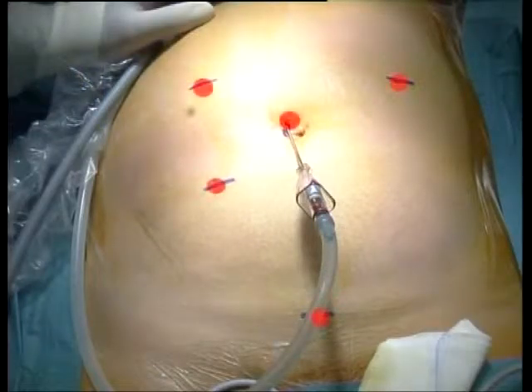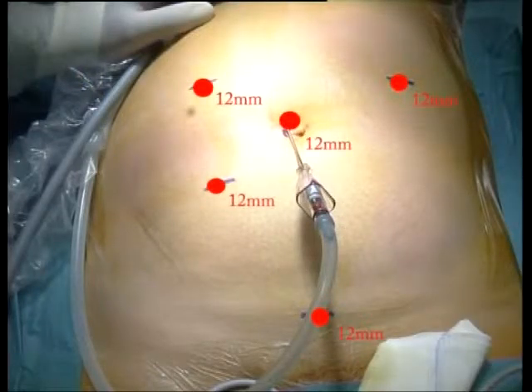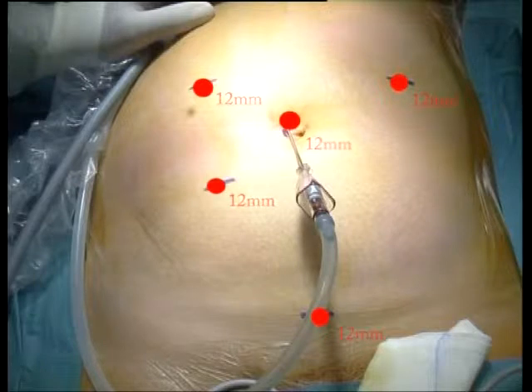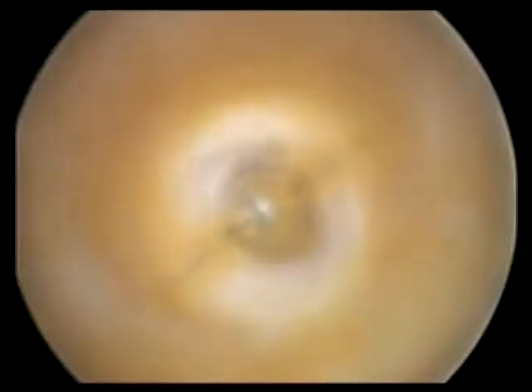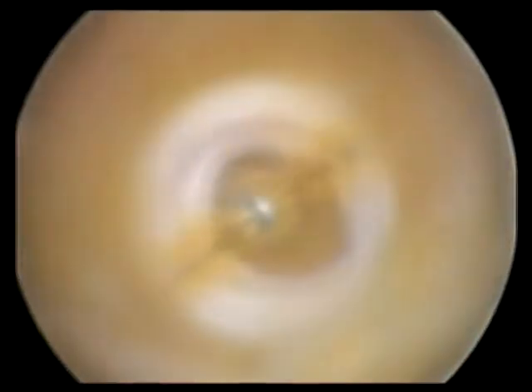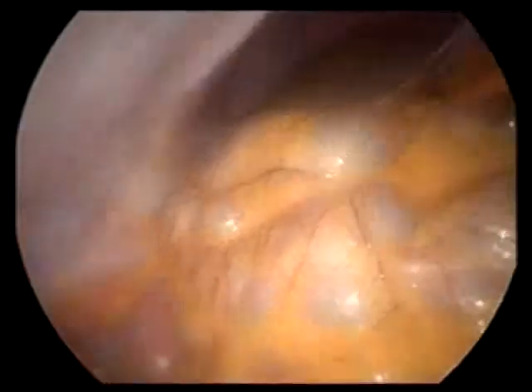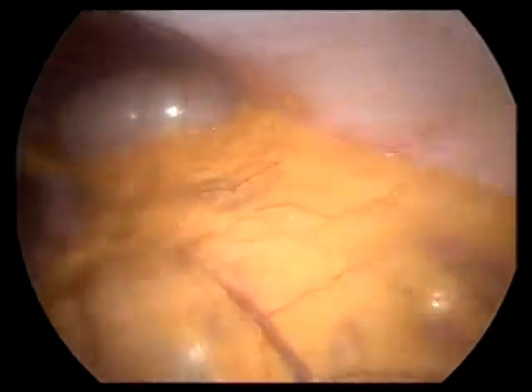Pneumoperitoneum is normally created by the insertion of a Veress needle through the umbilical scar. Five trocars are then inserted in the way that we utilize for left colectomies, under direct visual control. The operator starts the procedure from the right side of the patient.